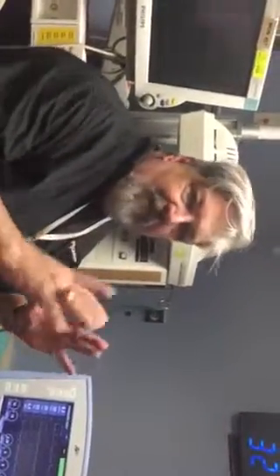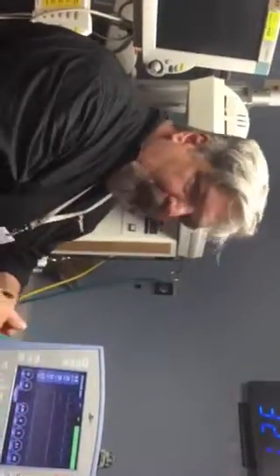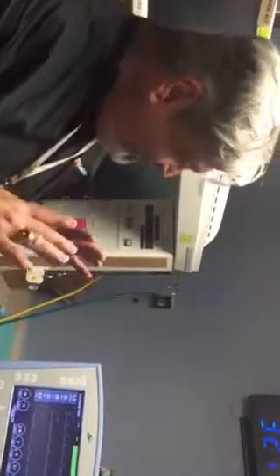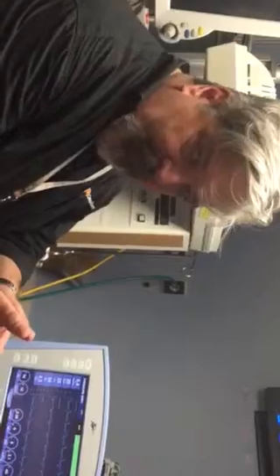The ventilator will then look at every breath that comes back from the baby. If it matches that target, it won't do a thing. If it doesn't match that target, the next subsequent breaths, it will either increase flow or decrease flow to try to get back to that target. Okay, so it's just a safeguard to keep my tidal volumes closer in a safe range.